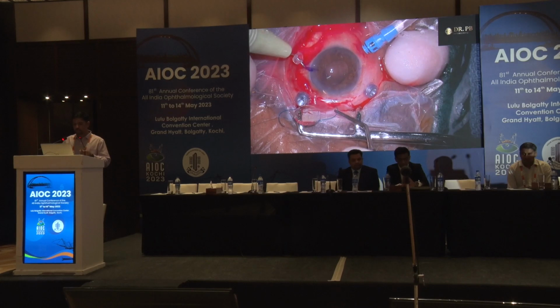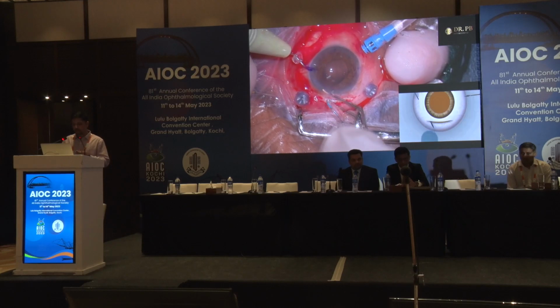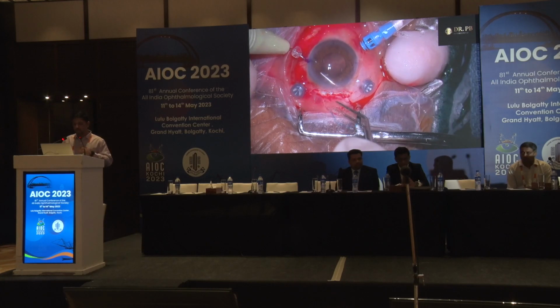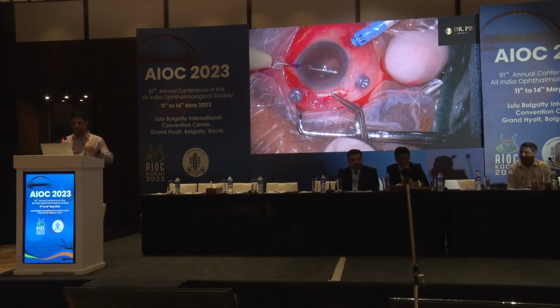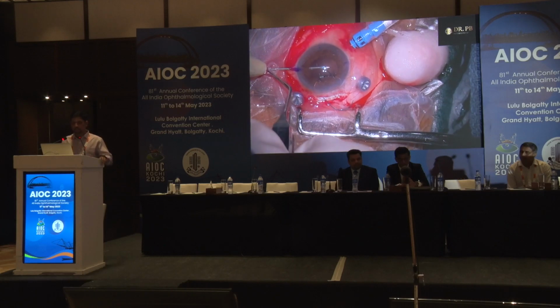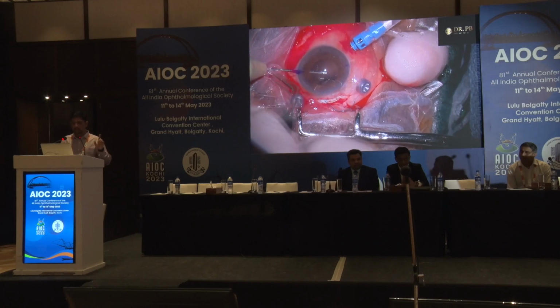And then what you do is just docking. This is all about XNet. The intraocular maneuver is avoided. You dock the haptic of the IOL at a safe extraocular location. Once you dock it, you retract the needle and at the same time push the IOL inside. This retraction and pushing should happen simultaneously, hand in hand. You don't retract and push separately. Once this is done, you don't do anything intraocular. As I said, intraocular maneuvers are completely avoided.